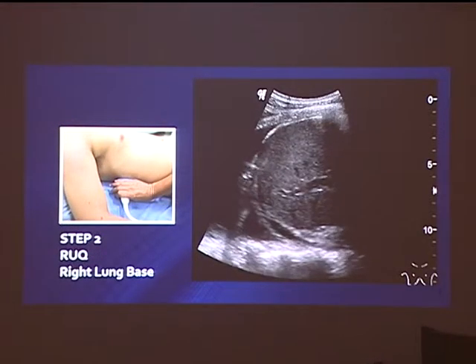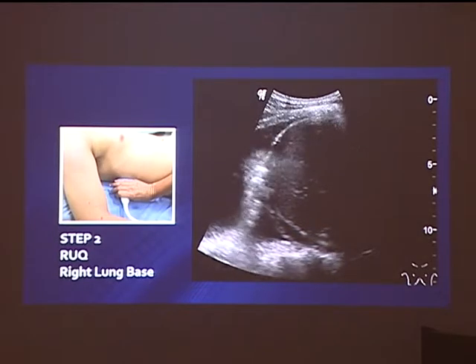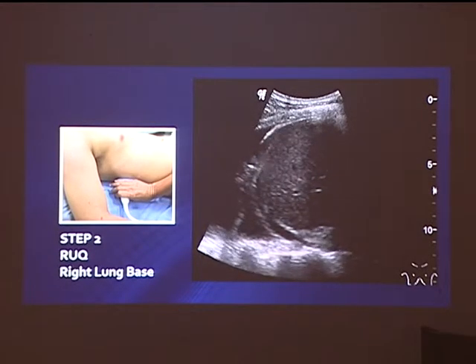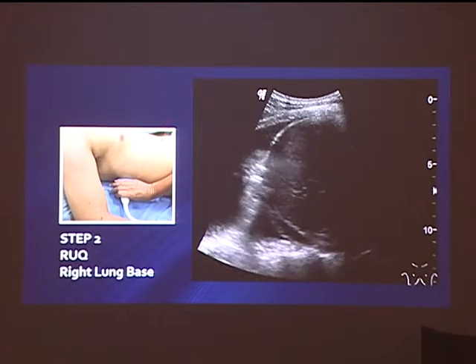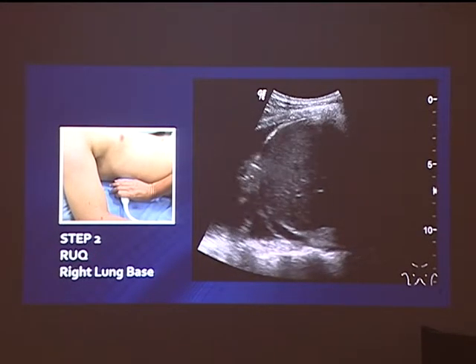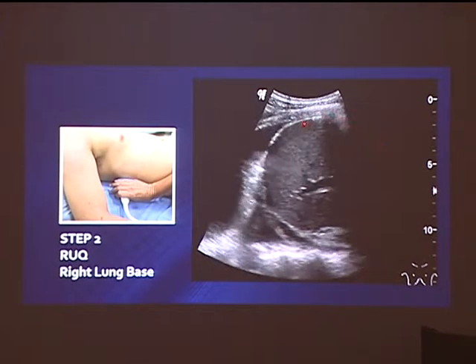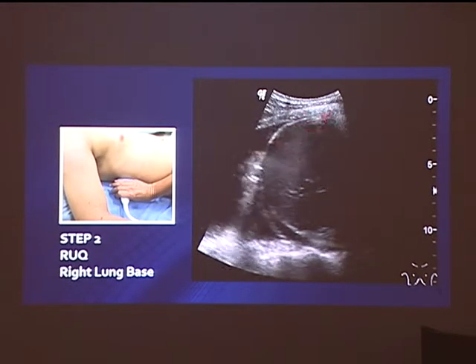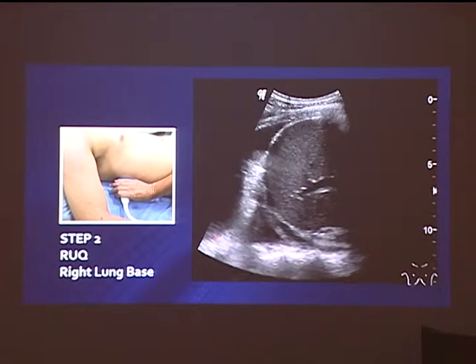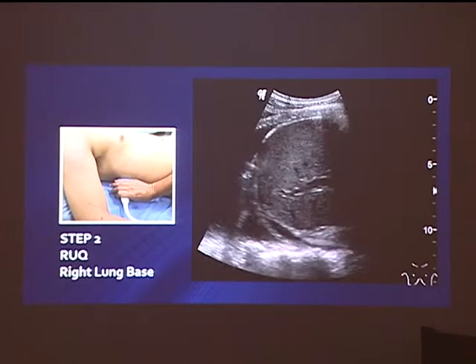Right lung base — what's missing here? The curtain sign is gone. The lung has been pushed to one corner and can no longer expand. As I said before, you should not be seeing this part of the diaphragm — but you are. Therefore there is a hemothorax — a pleural effusion, which in trauma is hemothorax. There's also a suggestion of fluid in the sub-diaphragmatic space, so more targeted scanning is needed.